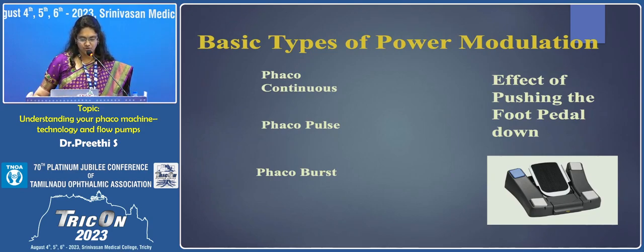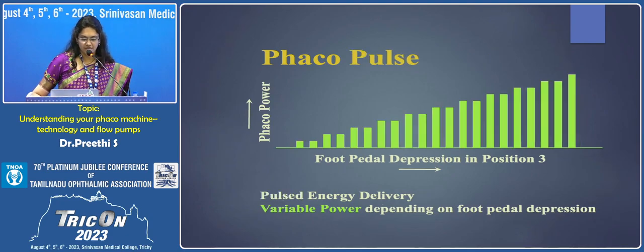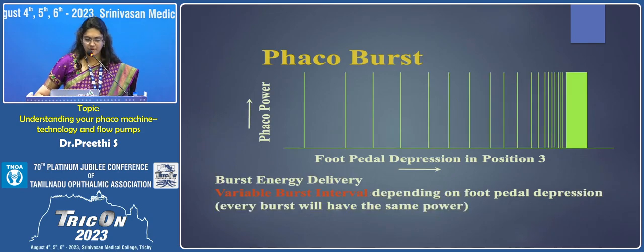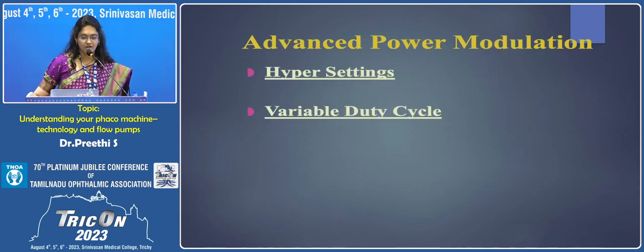Thank you. So we need to know what is phaco continuous, phaco pulse, phaco burst. This is continuous energy delivery, variable phaco power depending upon the foot pedal depression. And this is pulse energy delivery, variable phaco power depending on the foot pedal depression. And in burst, you have variable burst interval depending on the foot pedal depression. Every burst will have the same power. Advanced phaco modulation, we should know a little bit about the hyper setting and variable duty cycle.